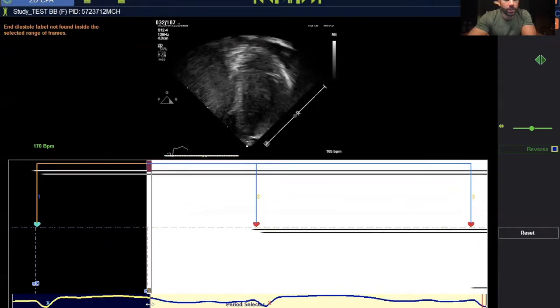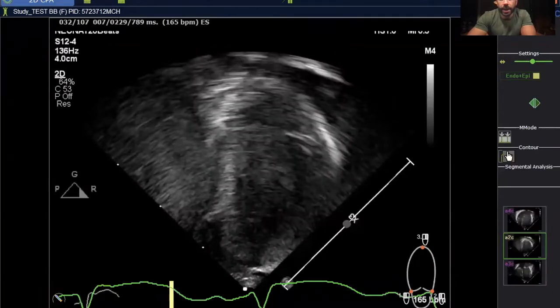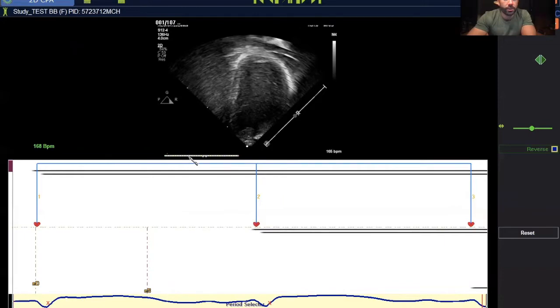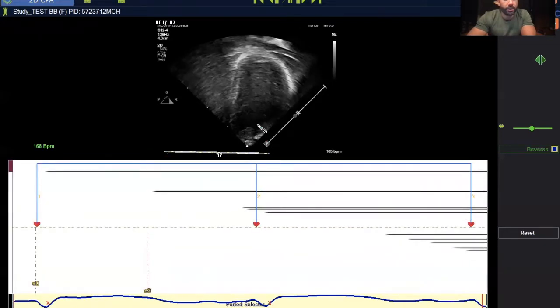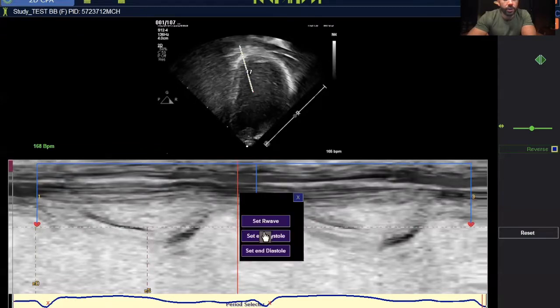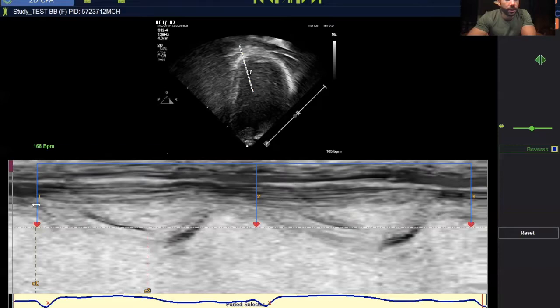Using the period selector, you can identify end of diastole — when the ventricle is completely filled, close to the beginning of the QRS — and end of systole, just before valve opening. Select the entire period. To recap: this M-mode zone is important for selecting which cardiac cycles to analyze. Ideally you want two cardiac cycles. Identify your R-waves, use the QRS tracing or M-mode to mark them using the right-click set R-wave function, then select your end diastole and end systole.